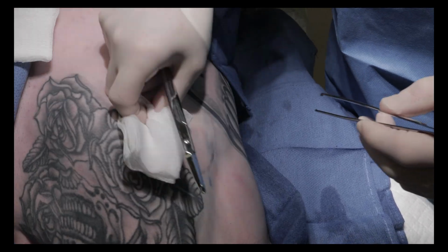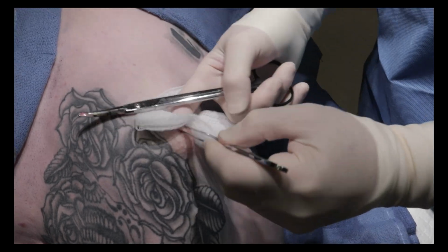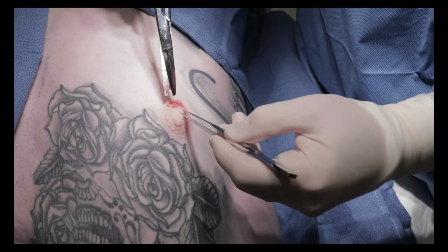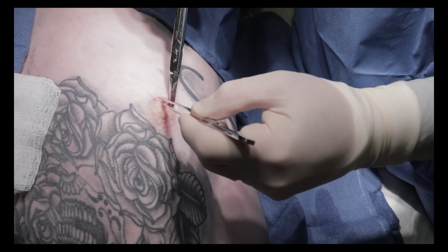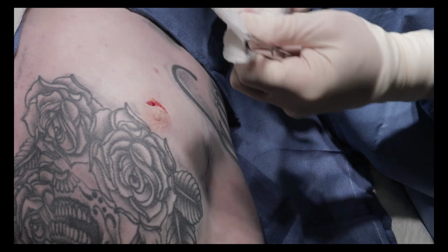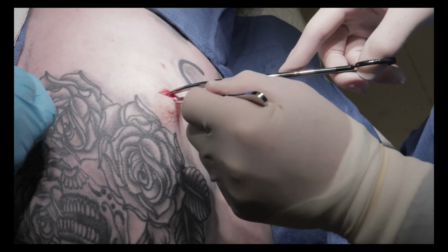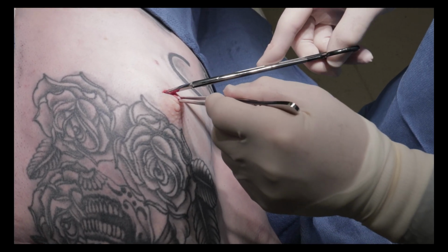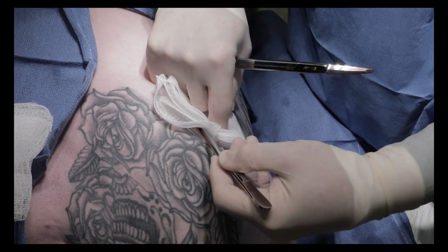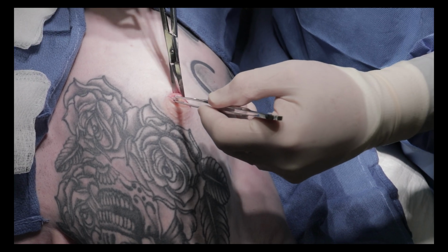Make sure it's all freed up. So next, once that's done, grab the gland itself. I have my own special technique of kind of scraping the fat out. And just chase the sucker on the sides and bottom. And the tail. And just find where it kind of turns the corner.